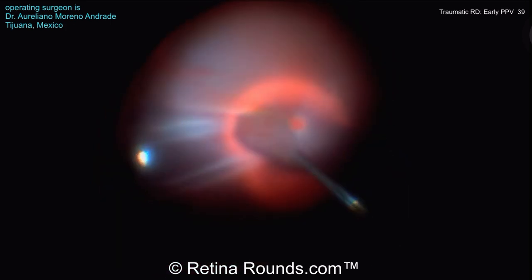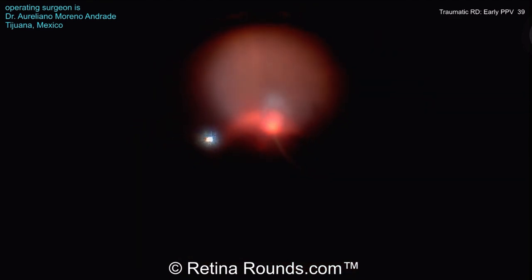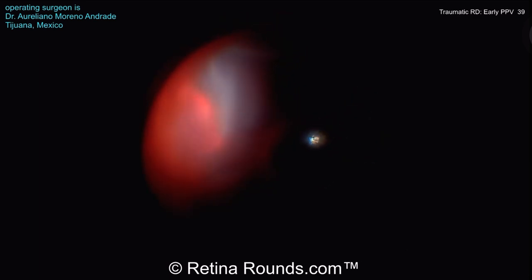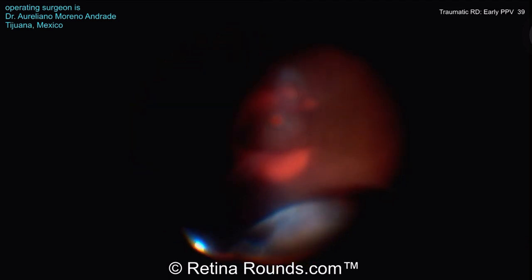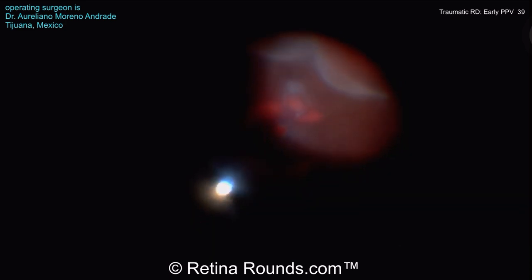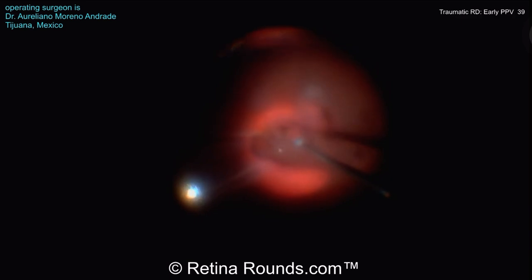Now he has a better view. And it looks like just inferior to the optic nerve, inferonasal to the optic nerve, there's a little break there. And so he's going to apply some endolaser. The fact that the endolaser is taking indicates that that break is in attached retina. Now looking at where the retina appears to be sort of streaming into the area of the globe rupture, checking peripherally just to make sure that there aren't any other retinal breaks.